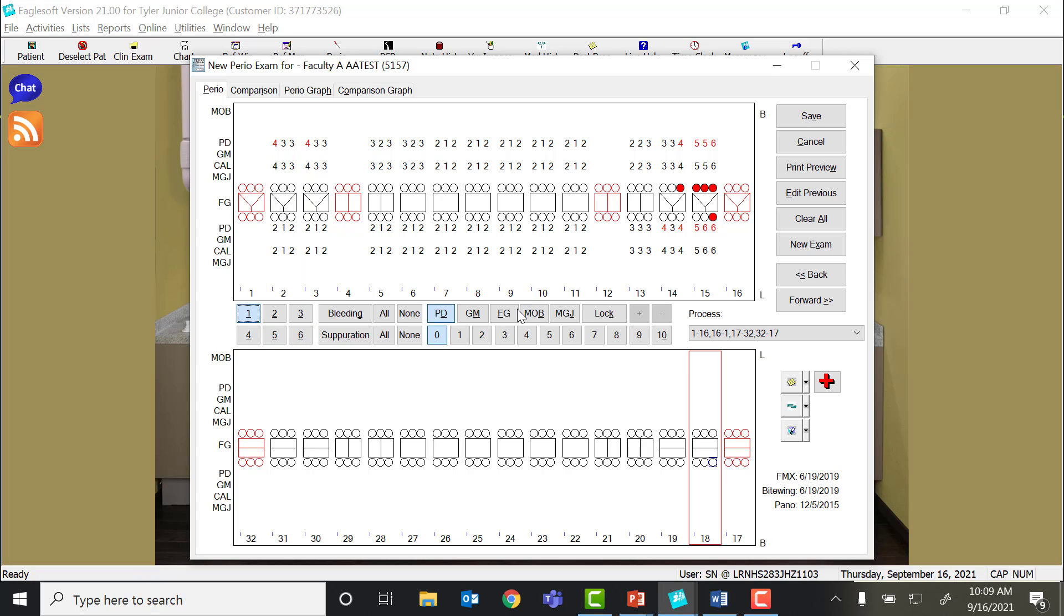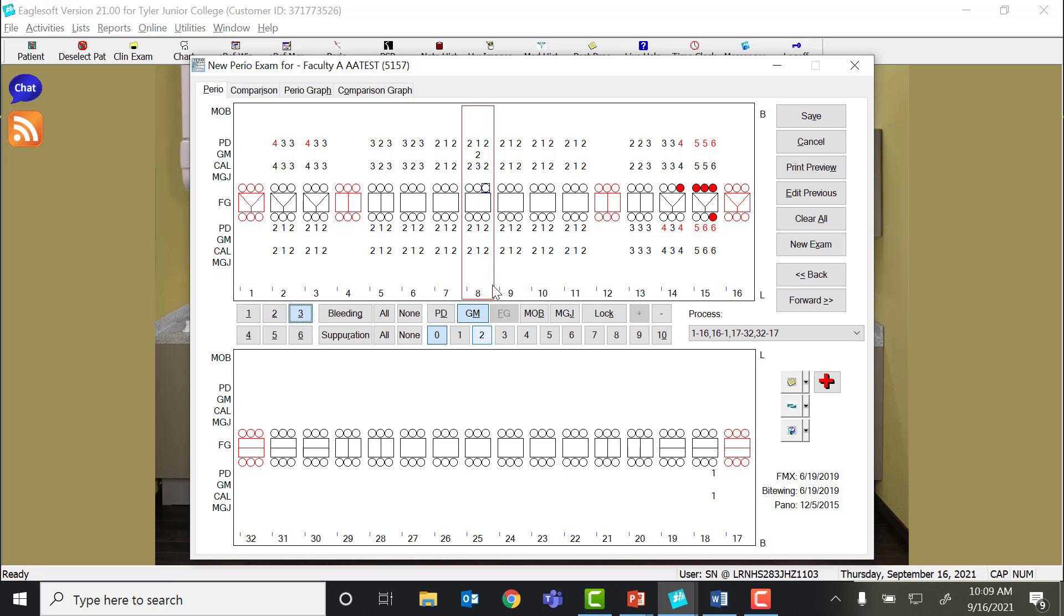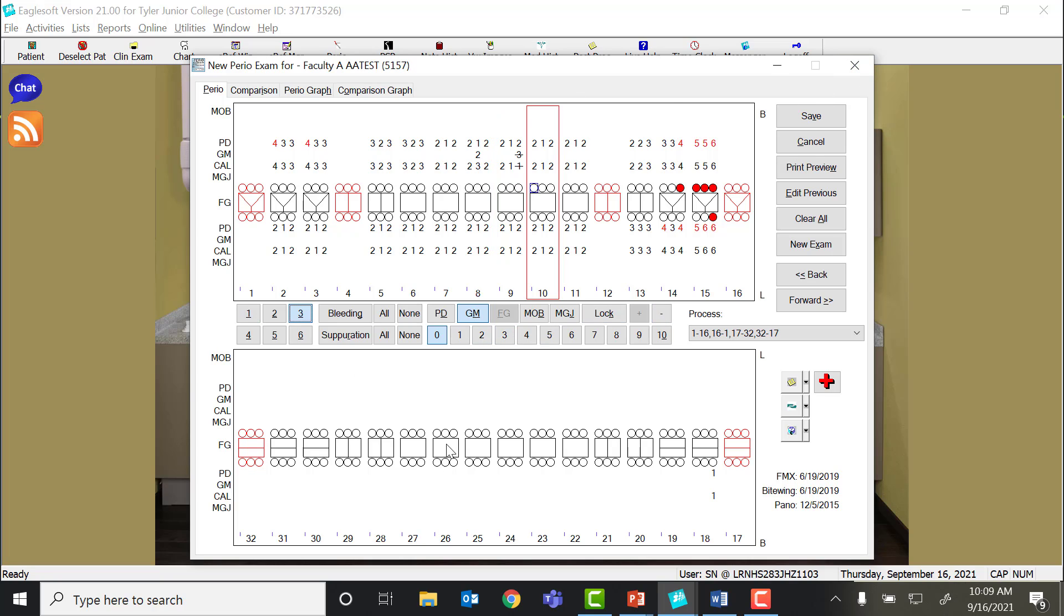And then it's automatically going to drop down to the mandibular. To do recession, quick recap: click your area, gingival margin, and how many millimeters of recession or inflammation by clicking the negative button and then clicking the number. And that will add in the enlargement. That is how you will do your periodontal charting in Eaglesoft.